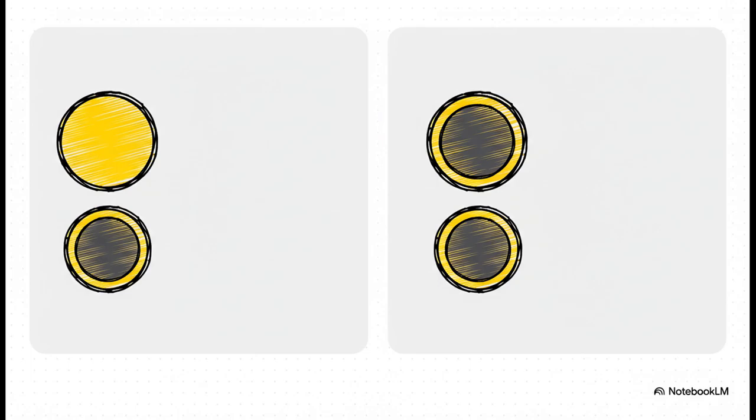But here is the absolute number one key difference. Metastases do not have that rapid central washout. The tumor holds onto the dye. So not seeing that billboard shutting off is a huge clue that we're looking at something different.